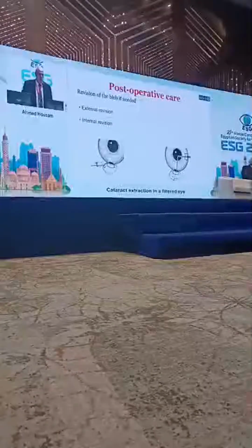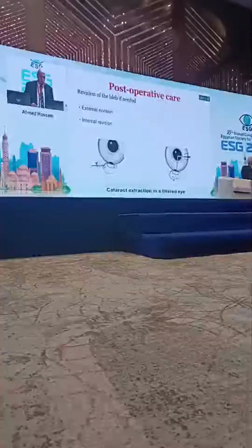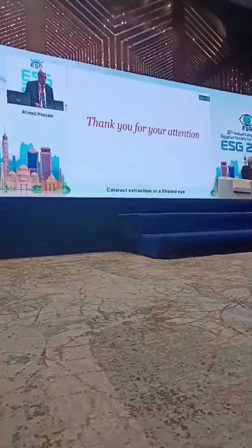Finally, if the bleb fails, we can do revision of the bleb either by external revision or internal revision. Thank you for your attention.